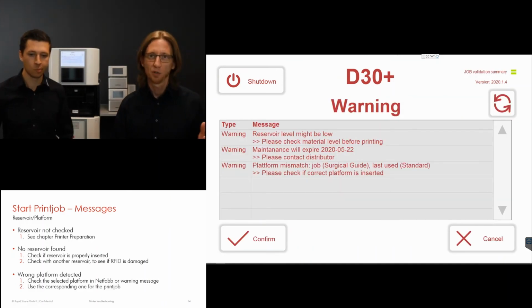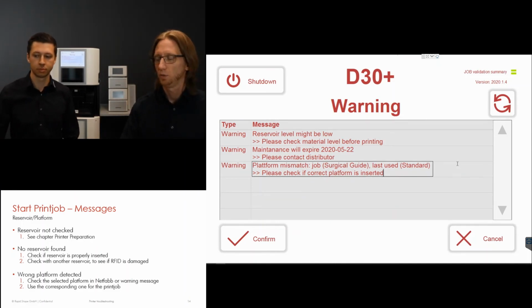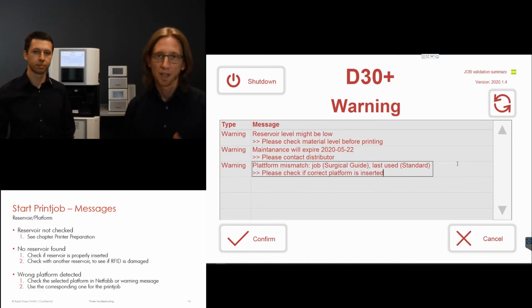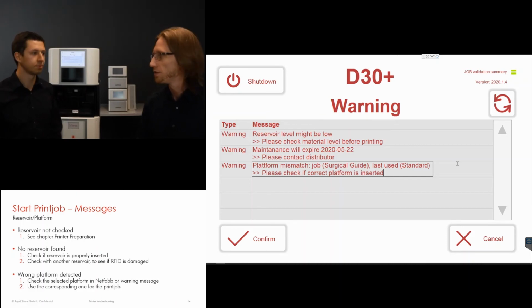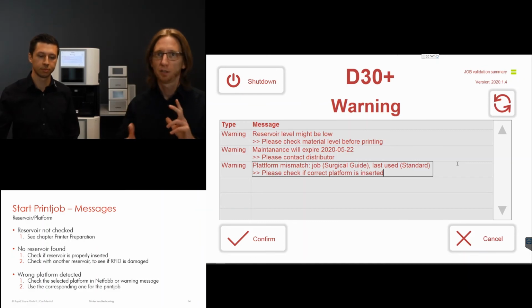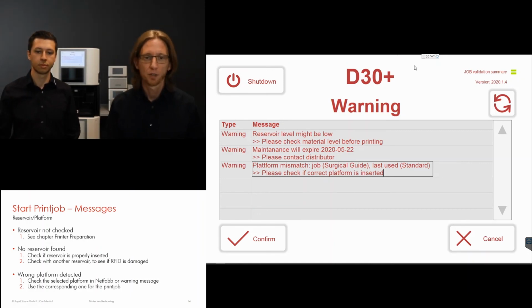So what you can see here is a platform mismatch. This happens if you have used a different platform in the previous job and a different one in the latest job. As you all know, we just have two different types of platforms in use. There could be a standard platform, which you can see on the machine installed right here, and in addition to that we have the surgical guide platform. The information which kind of platform is used, the machine will find in the job file, and it all depends on the selection in NetFab.